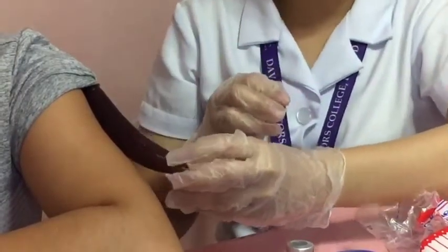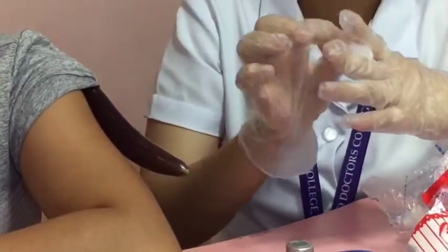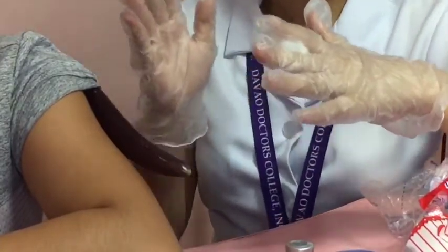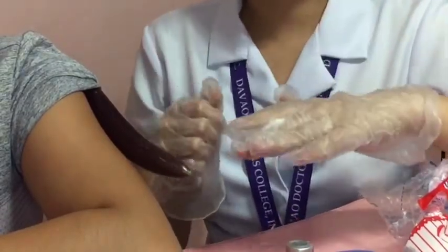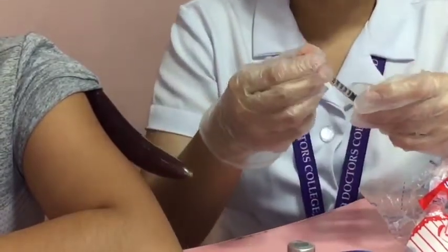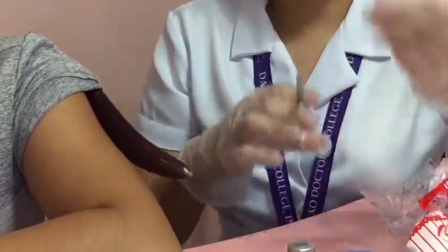So now let's hold a swab between our third and fourth finger of our non-dominant hand, or position the swab on the client's skin above the intended site. This technique keeps the swab readily accessible when the needle is withdrawn. Now let's prepare the syringe for injection. First, let's remove the cap. Pull the cap straight off, avoiding contaminating the needle by the outside edge of the cap.